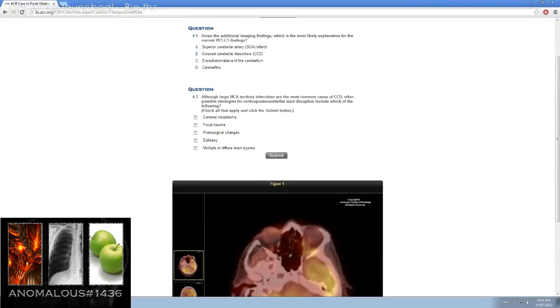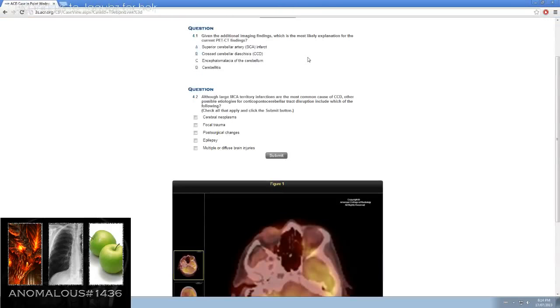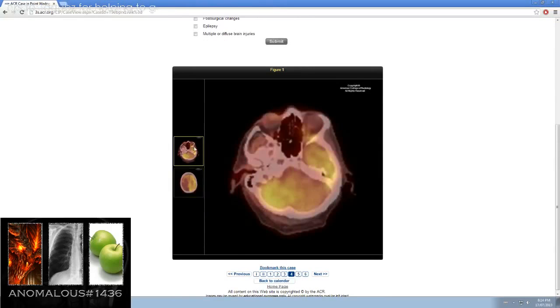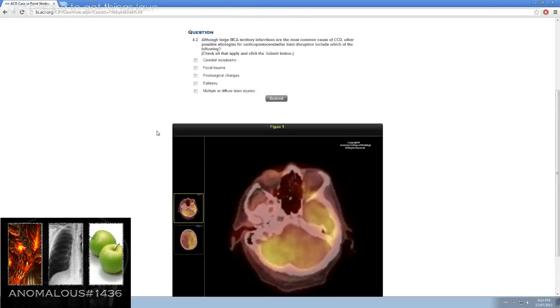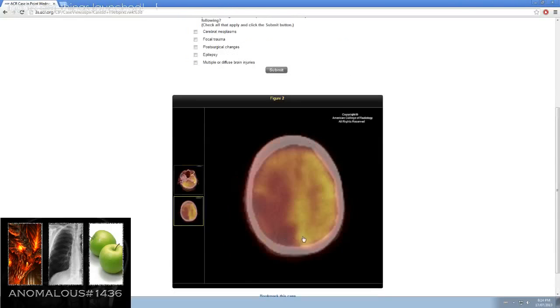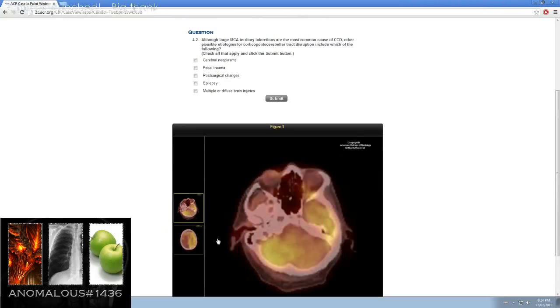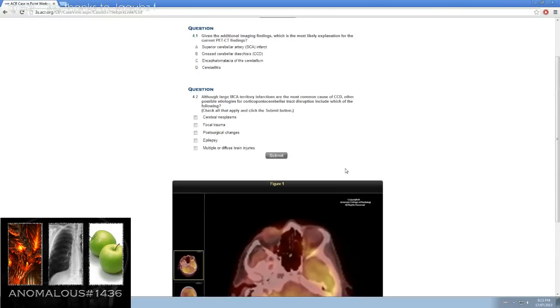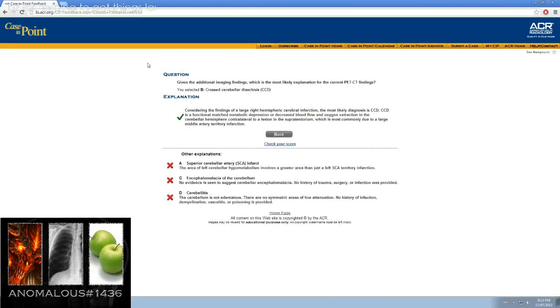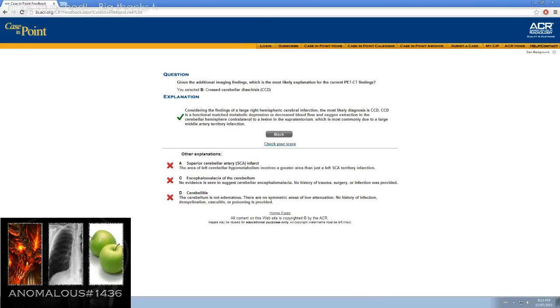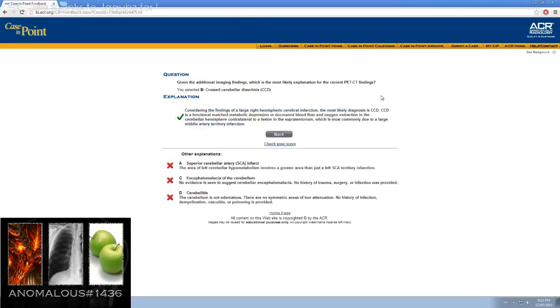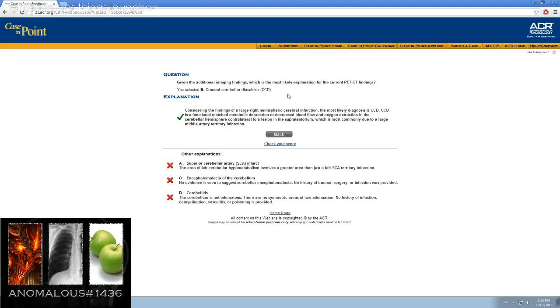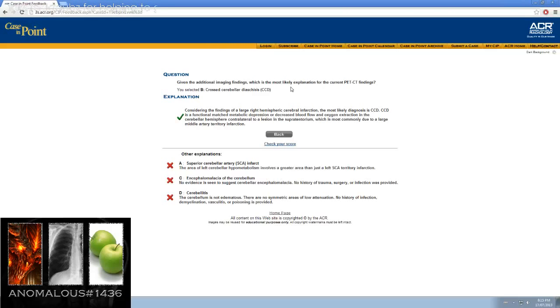So given the additional imaging findings, which is the most likely explanation for the current PET CT findings? We have right ICA abnormality causing this left cerebellar hypoperfusion. I think it might be this crossed cerebellar diaschisis. Considering the findings of a large right hemispheric cerebral infarction, the most likely diagnosis is CCD. CCD or crossed cerebellar diaschisis is a functional matched metabolic depression or decreased blood flow and oxygen extraction in the cerebellar hemisphere contralateral to a lesion in the supratentorial, which is most commonly due to a large middle cerebral artery territory infarction.